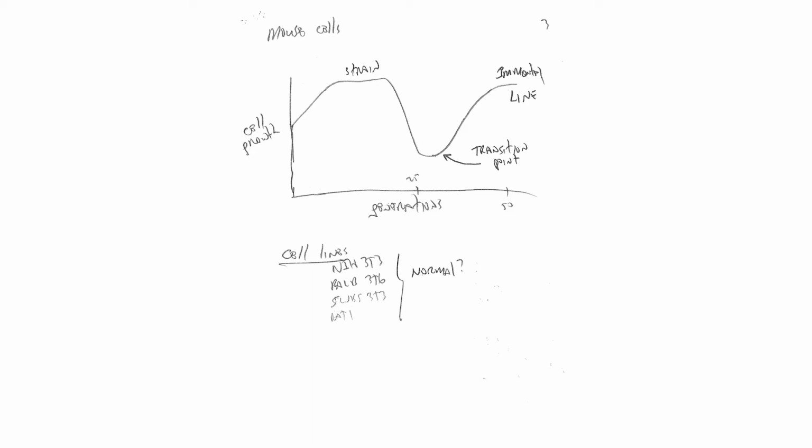Now, what I had told you so far is that these are in the presence of the serum, but as time goes on and people are studying different kinds of cells, we are starting to learn what kinds of factors, rather than just simply adding 10% serum, what kinds of growth factors or what kinds of hormones are required to grow cells. So this is shown in the next table.